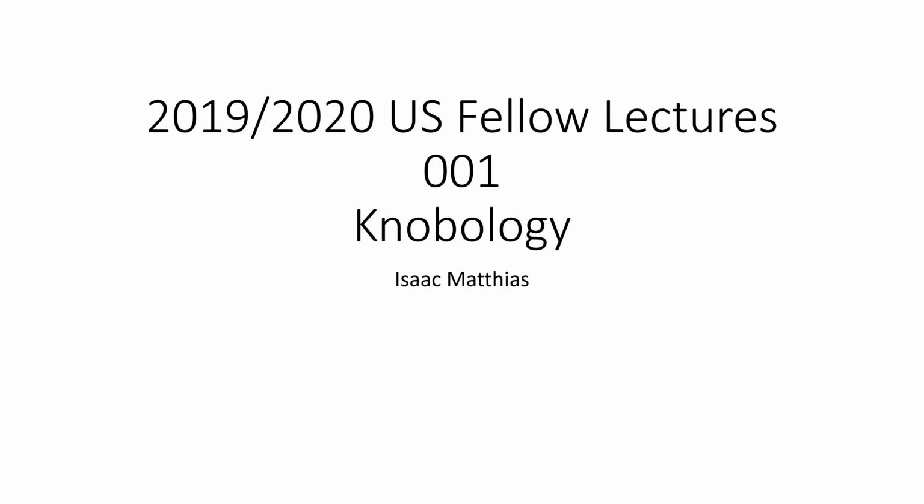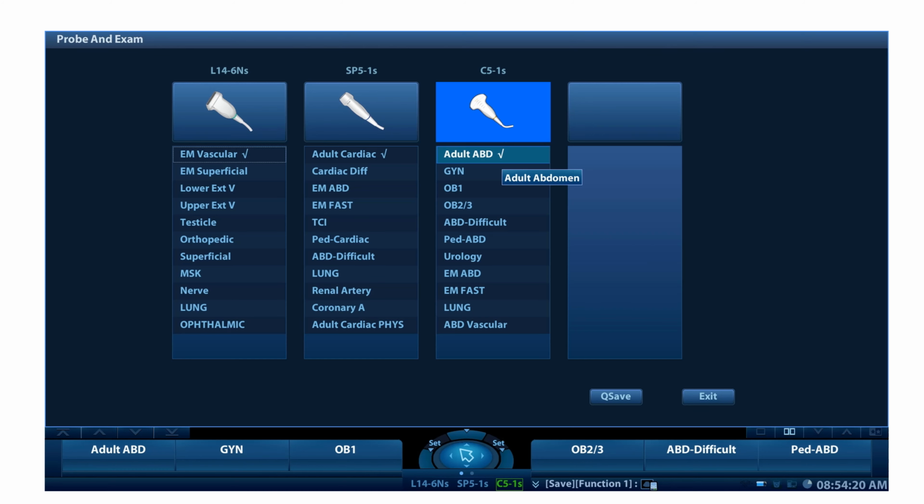I am the co-director of the IM portion of the EM-IM Ultrasound Fellowship at Penn, and this is the start of our 2019-2020 Ultrasound Fellow Lecture Series. So we're going to start off today with Knobology.